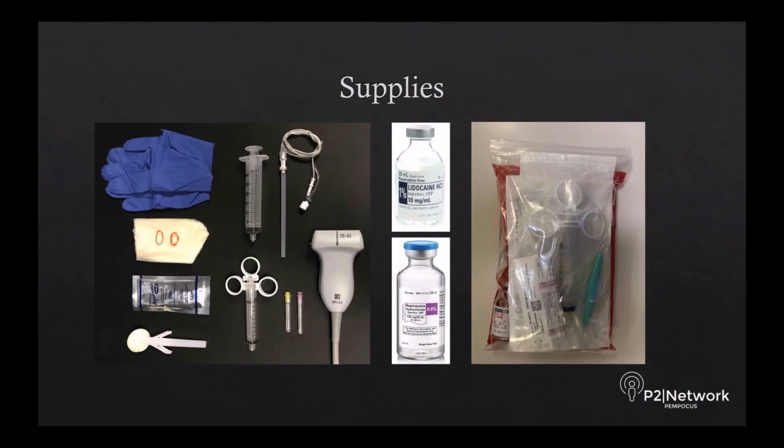Supplies needed when performing the block are your sterile supplies. In this case, we have sterile gloves, your sterile probe cover, and sterile gel. Something to clean the skin. In this case, we've got a ChlorPrep.